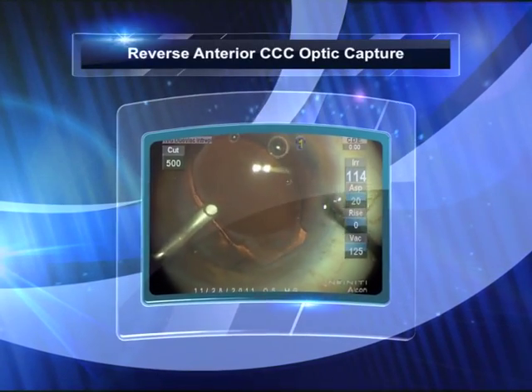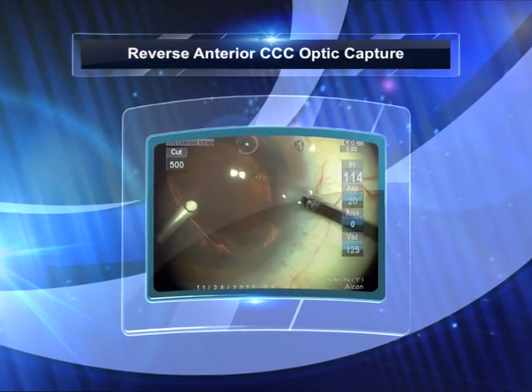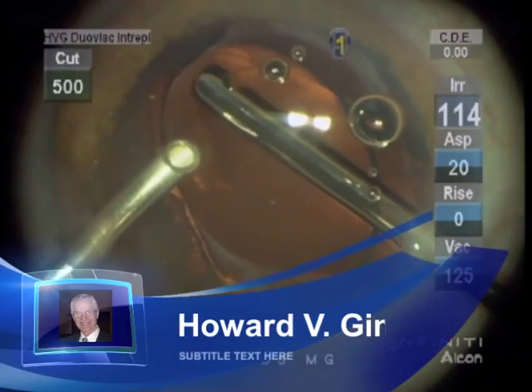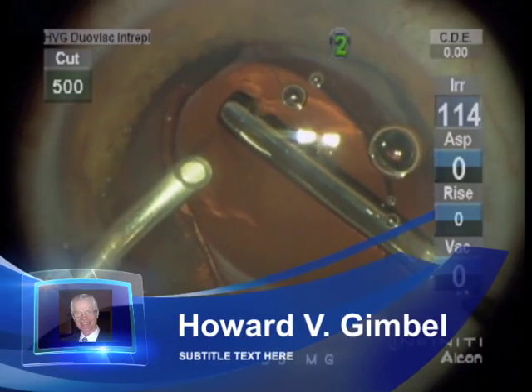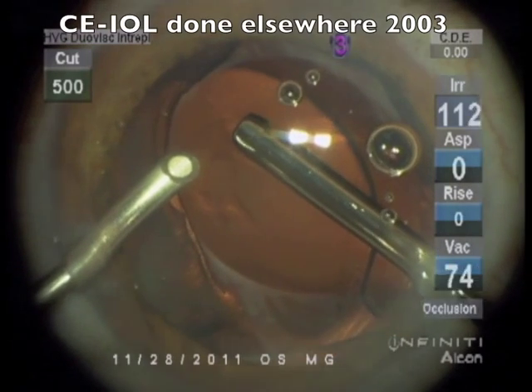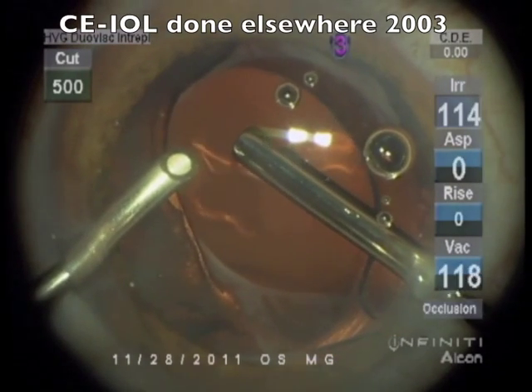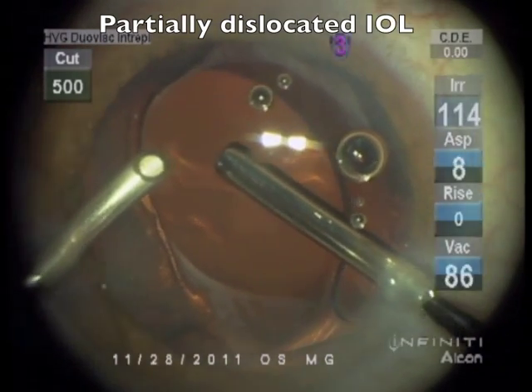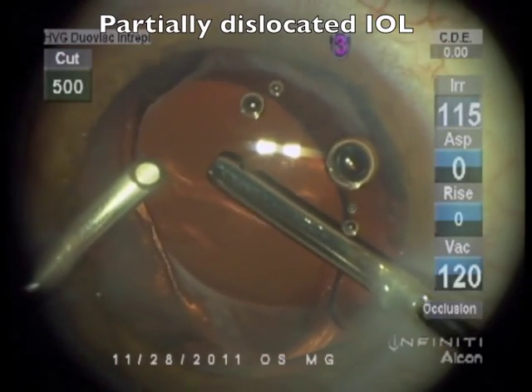I would like to show a case where membrane optic capture solved the problem of significant lens tilt, induced astigmatism, and a very high degree of higher order aberration.